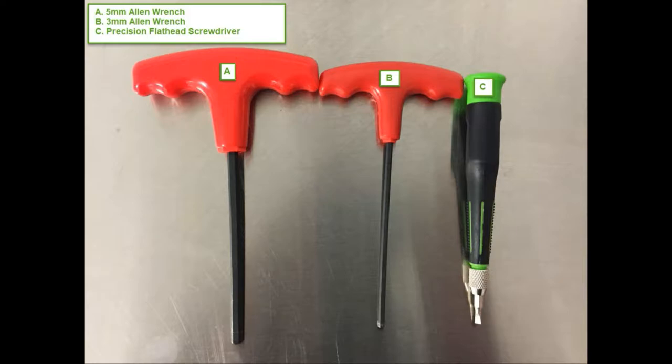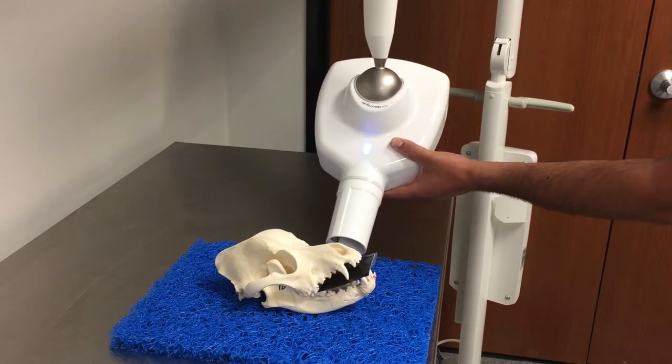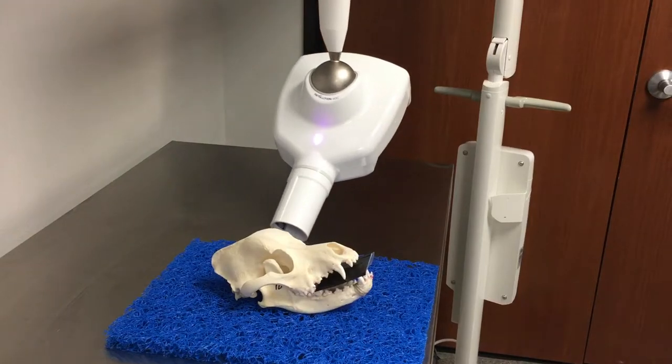In order to correct horizontal drift, you will need the following tools: one 3mm Allen wrench, a 5mm Allen wrench, and a small precision flat head screwdriver. If when positioning you notice the tube head drifting horizontally once you let go of the tube head, proceed as follows.